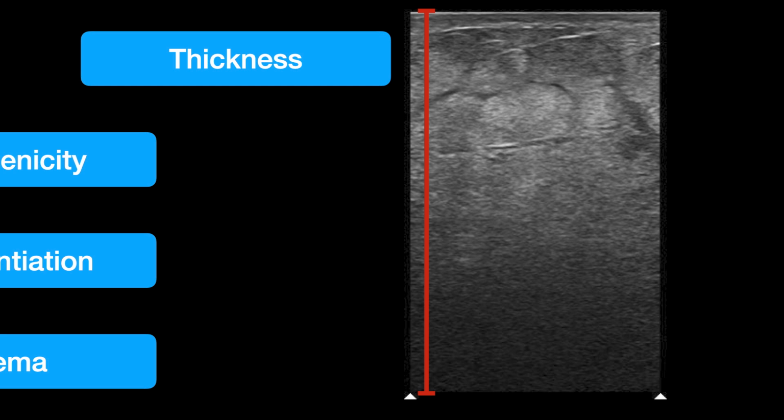If you remember back at the beginning of the presentation, we showed those different layers. We showed the epidermis and dermis, the subcutaneous layer, the fascia, the muscle and the bone, right? And so what we're going to see as we scan past the area or around the area is that the inflamed portion of the skin is going to be thickened, right? That subcutaneous layer, that marbled layer, is going to be thicker than the rest of the surrounding tissue.